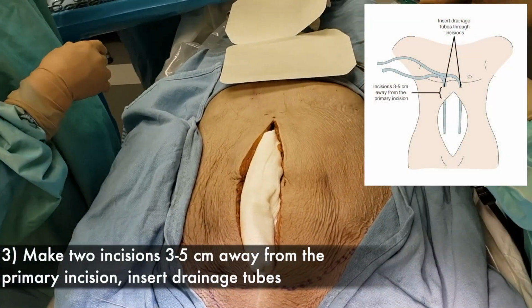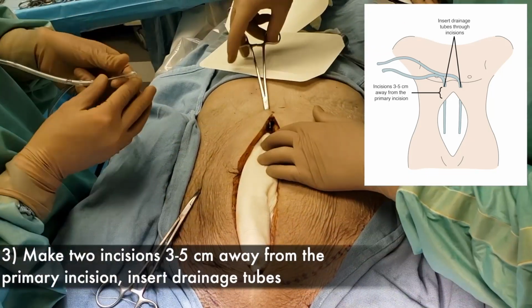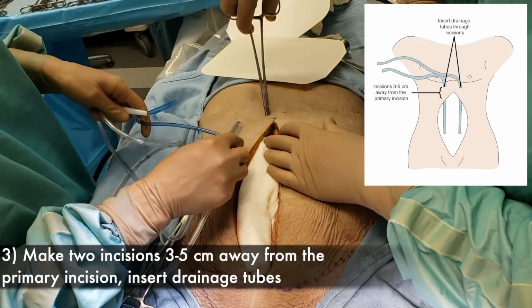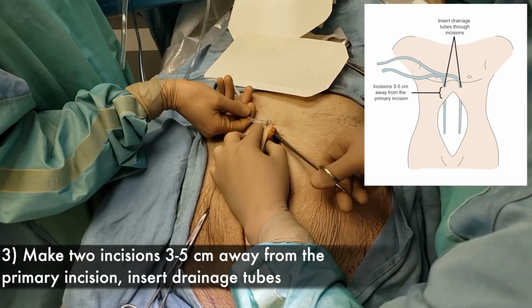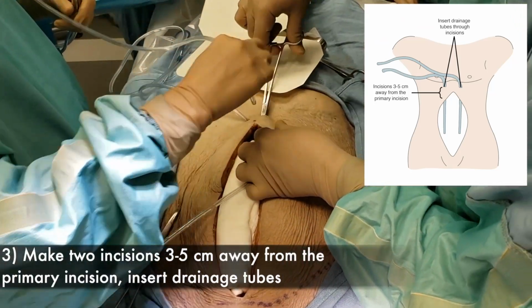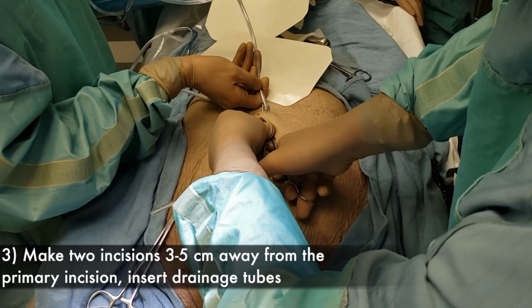Use a scalpel to make 2 small incisions, either superior to or lateral to the open abdomen. This video shows the superior location. For a longer primary incision, such as a trauma laparotomy, the lateral location should be chosen. Insert a drainage tube, such as a Jackson-Pratt drain, through each of these incisions using Kelly forceps. Tunnel the drainage tubes along the subcutaneous tissue.